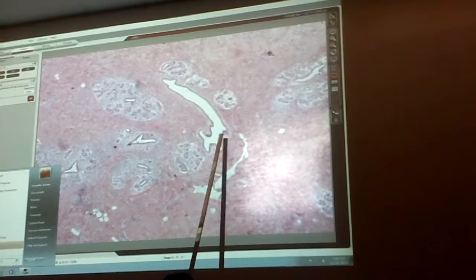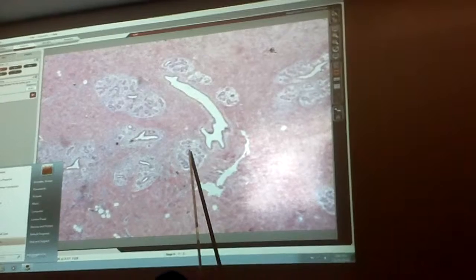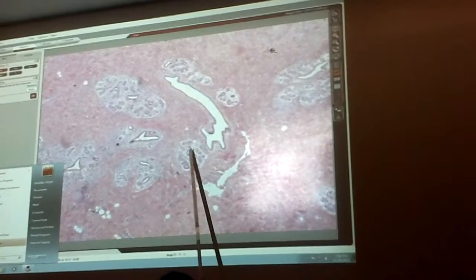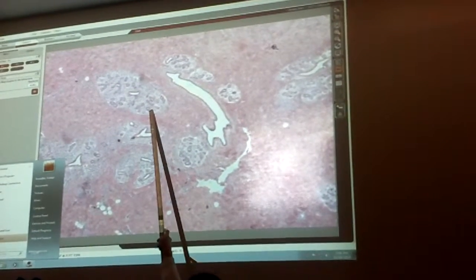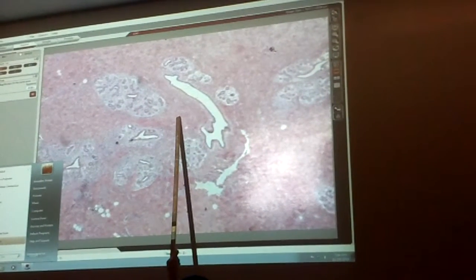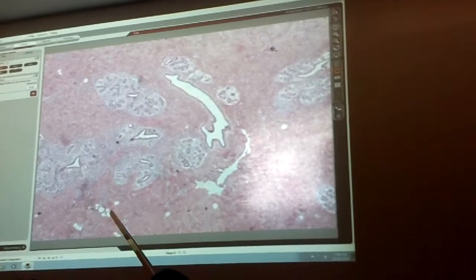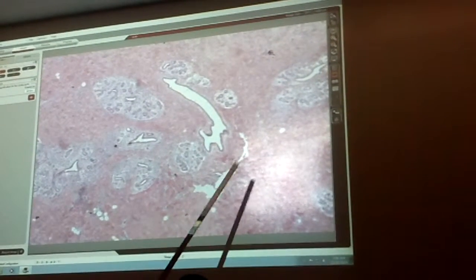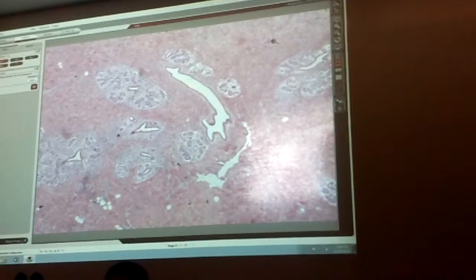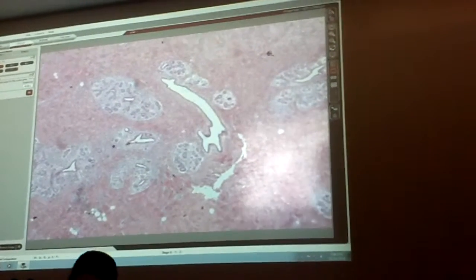So we have our lactiferous duct. Just that. Glandular alveoli, the whole area. Lobule. This stuff. Interlobular connective tissue. And this. Adipose. This is the resting, non-lactating, inactive mammary gland. Multiple names.